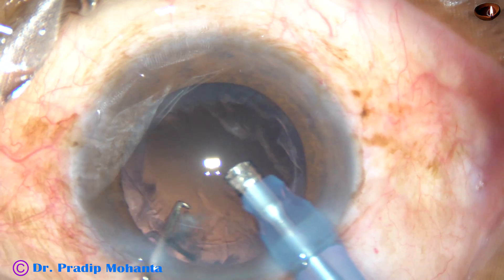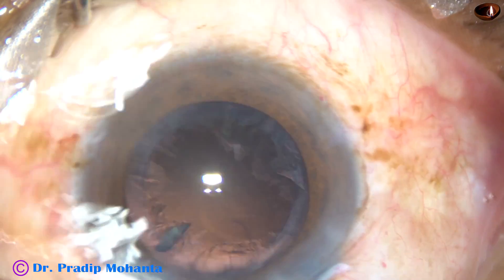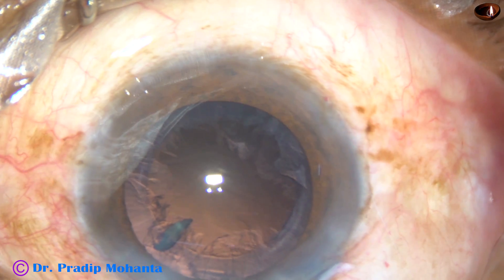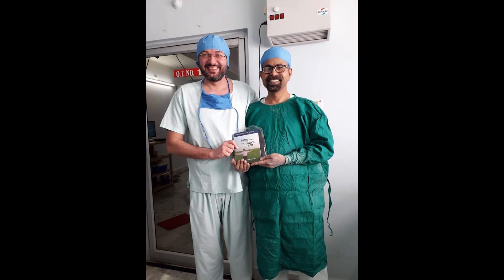That's it. The nucleus is nicely managed. And now, come out. Hope this video will help you in developing your surgical skills. Be a great surgeon and serve mankind with love, respect, compassion, and great surgical competence. This video is dedicated to my student, Alexander Jepthik from Serbia.